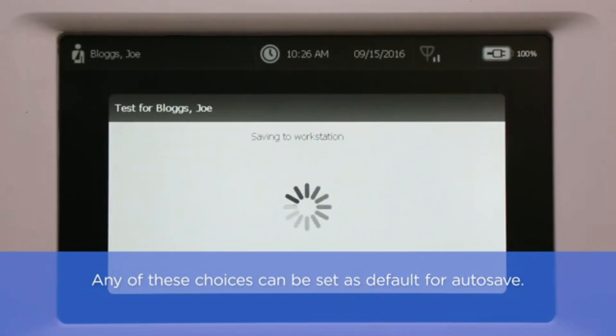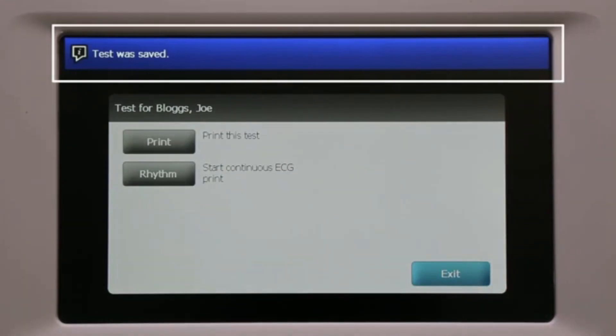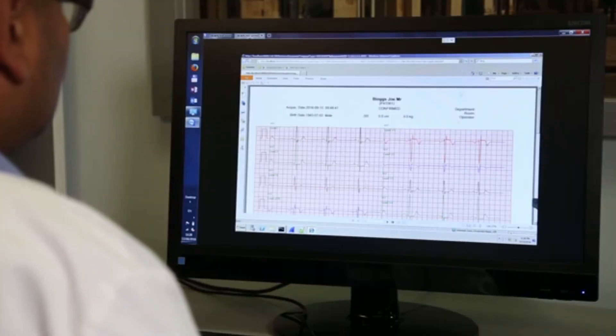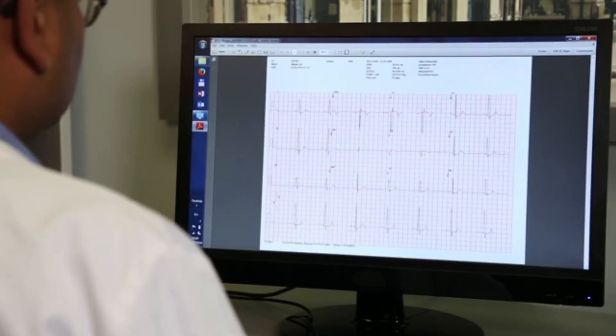Any of these choices can be set as default for autosave. After the test has been saved, a message appears in the message bar at the top to confirm the test has been saved. At this time, the test can be viewed on your DICOM viewer. Alternatively, you can print using the internal printer and save a PDF copy to a network folder.